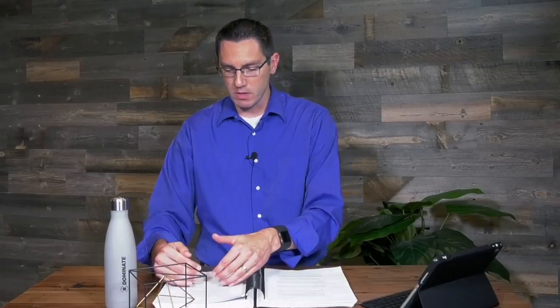We're going to move into the objective refraction. So we're kind of moving our way through an exam. We start out with acuity. Now we're going to talk about some objective ways that we can measure somebody's prescription. First, we're going to talk about everybody's favorite, retinoscopy. All right, so a couple of key points about retinoscopy. I know you guys know how to do retinoscopy, so if you forgot, it's going to be in there.